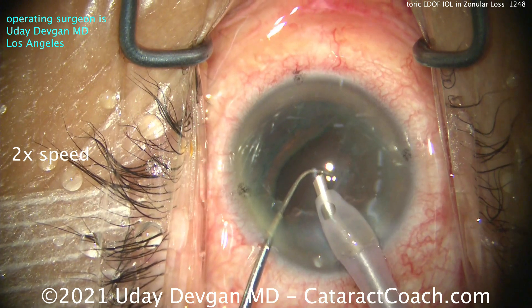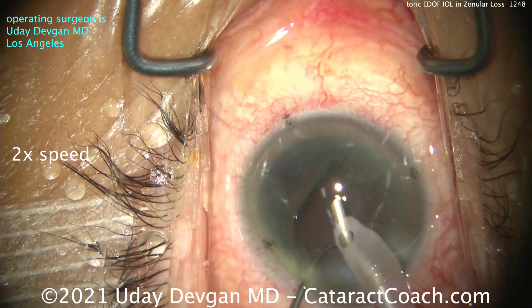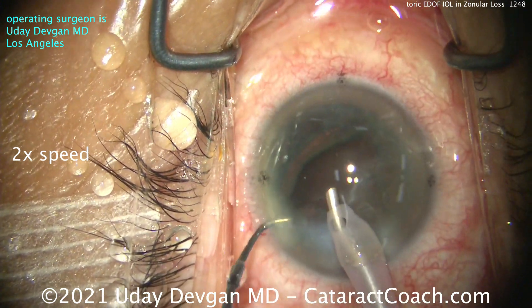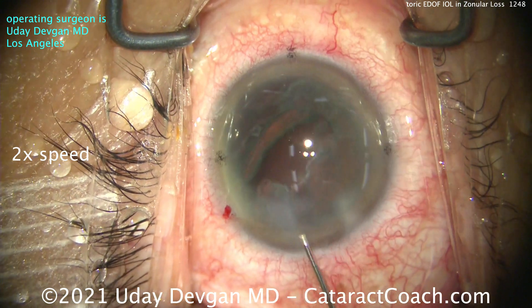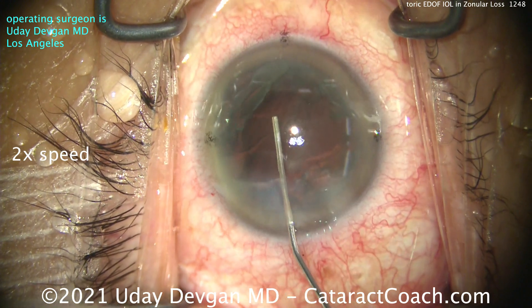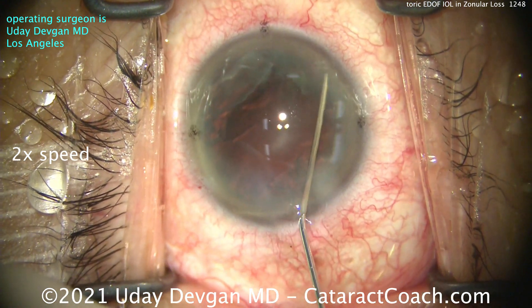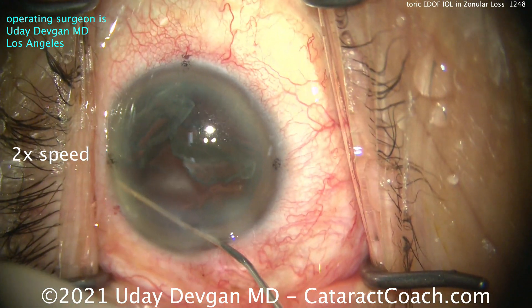Do you pull out capsular hooks? There are no capsular hooks in the eye — now what? Do you want to make do with iris hooks to hold that up? Well, let's try to go over to this side. Can I get some of this epinucleus out? Obviously one quadrant is tough. So let's put in some viscoelastic and stabilize things. I'm going to first seal up that main incision — I don't want it to leak too much. Viscoelastic is cheaper than vitreous, right? So let's try to visco-dissect away this epinuclear shell from all the quadrants.